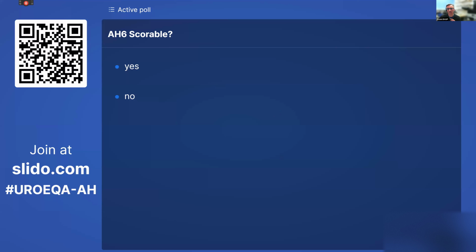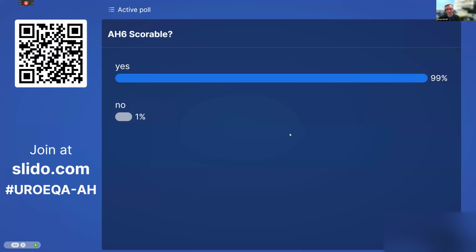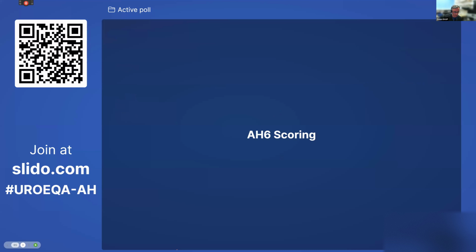Okay, so I'll stop that at 92. I think it is scoreable. So yes, 99%. And then again, if you go back to your phones, you've got the individual diagnoses. So again, it's 0, 0.25 and 0.5 because of the supplementary. And I'll just wait till 100 for this one.